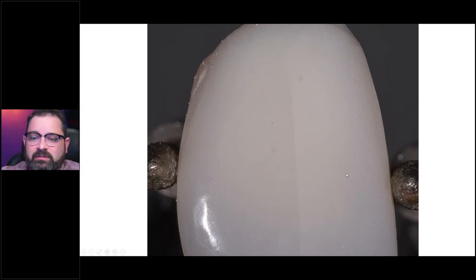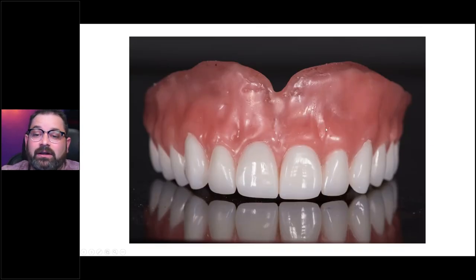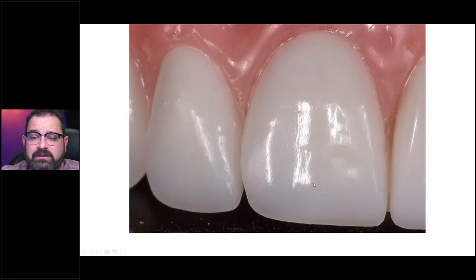I've been talking to people who say: if I put OptiGlaze on my denture tooth, it turns yellow and I can't change it. So I made a little experiment — I sandblasted just one side of the tooth and applied OptiGlaze to it. I asked them if they could tell which tooth I did it to. For me, I couldn't tell the difference. And I actually also put it on number seven. So if you do the proper application with proper curing and no contamination, you can get a fairly decent result.